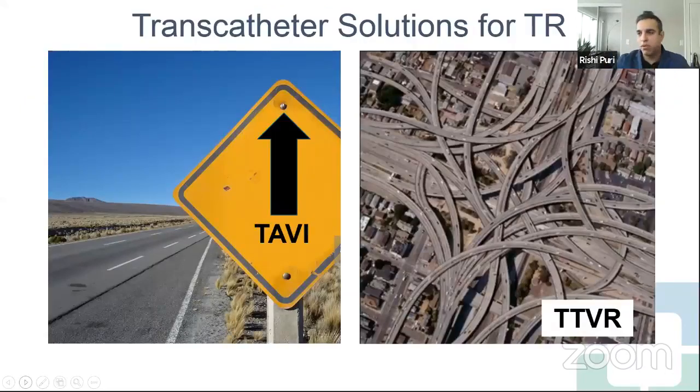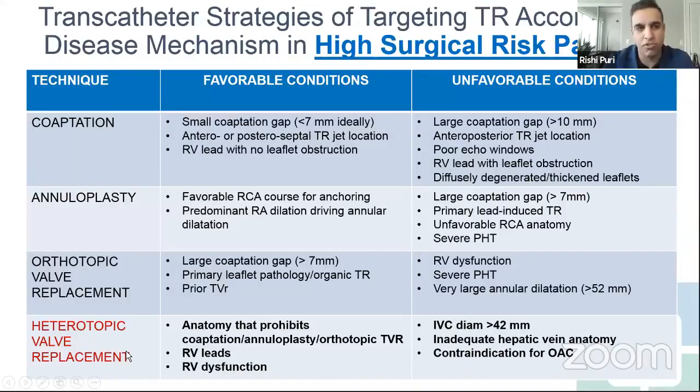So as you probably all know, TAVI was a breakthrough technology in structural heart. And TAVI is relatively simple when we look at some of the technologies and devices that we're trying to apply to the mitral and tricuspid space. And so, as you can certainly appreciate, the path to successfully treating tricuspid valves has been a little more complex and continues to remain complex.